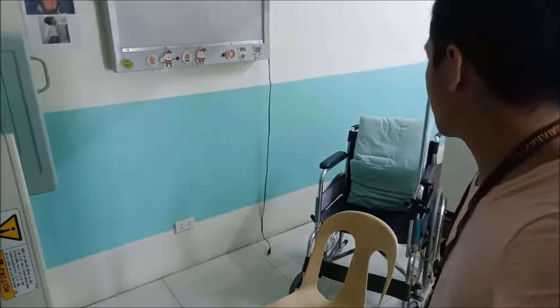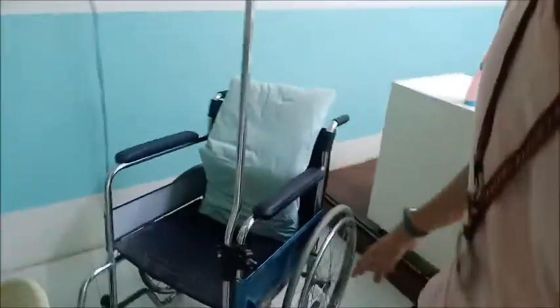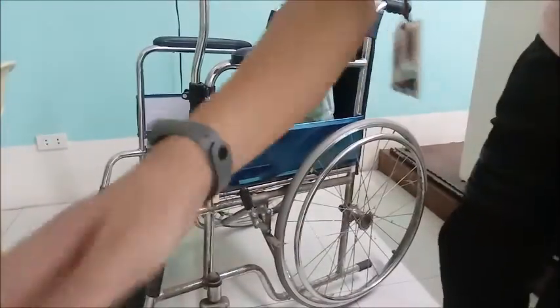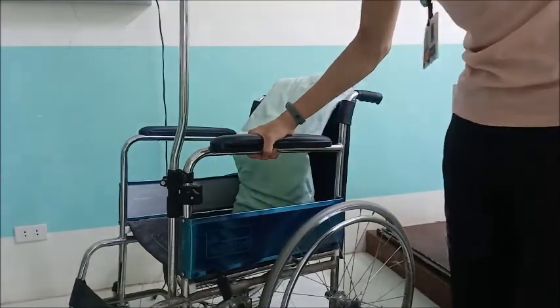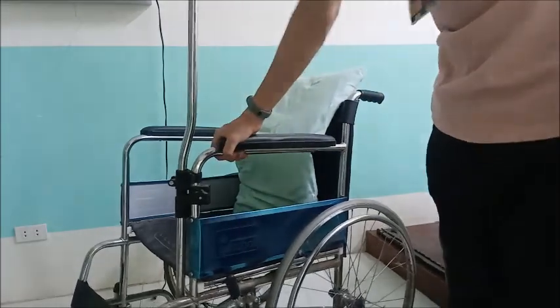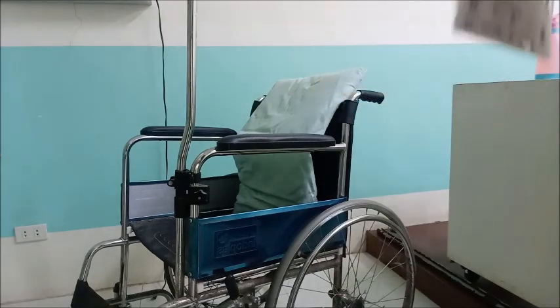So, just to examine the patient na wala ang railings. But in some hospitals, that's why you have to be familiar with your equipment, the side rails of the wheelchair can be removed. But unfortunately, for this type of wheelchair, naka-fix na siya.